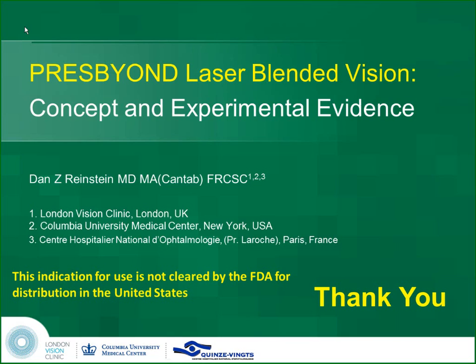In fact, I'd like Gunter to comment on a literature search that I did before I came. And this summarizes all of the latest iteration, ACI 7000, and talk about reproducibility of studies, because your outcomes are fantastic, but amongst these other studies that have been published with the same device, including Tomita's results, there is a loss of 2 lines in a number of studies, and including Tomita, who's arguably the most experienced implanter in the world, for myopic LASIK combined with the implant. I wondered if you could comment on that.